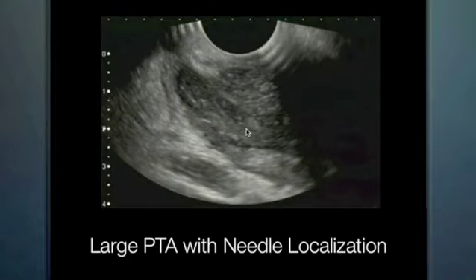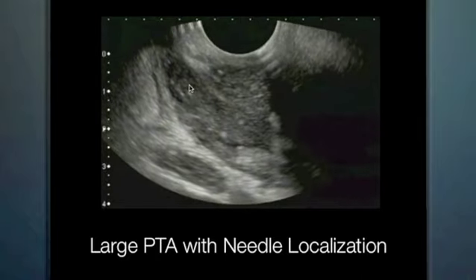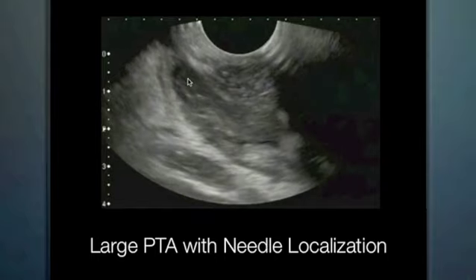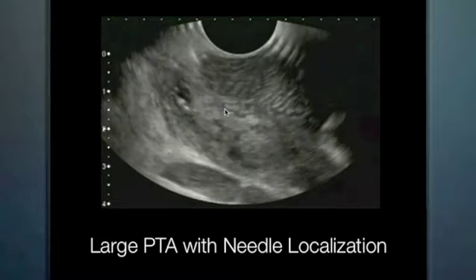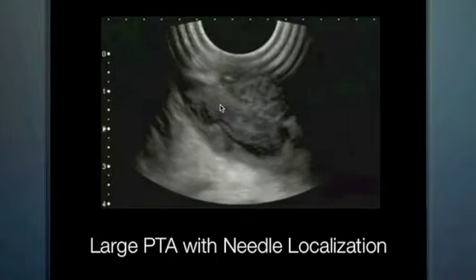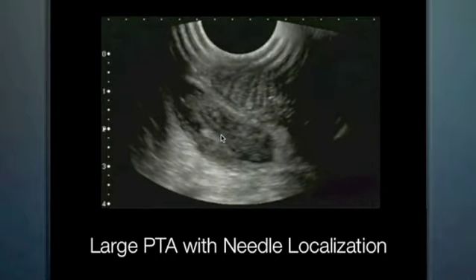severe degree of a peritonsillar abscess, you may find that some of these are so large that they're very easy to drain, or that they're so extensive that they may need to be actually drained in the operating room for maximum comfort and securing of the airway. However, ultrasound does help to differentiate how difficult or easy a drainage procedure could be. And we can localize the needle.